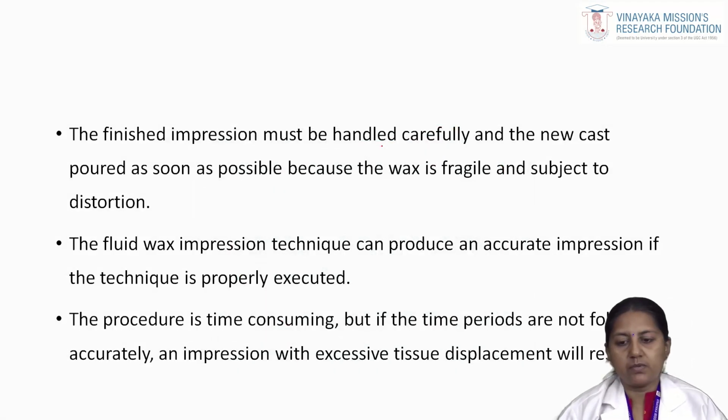The finished impression must be handled carefully and the new cast must be poured as soon as possible because the wax is fragile and subject to distortion. The fluid wax impression technique can produce an accurate impression if the technique is properly executed. The procedure is time consuming, but if time periods are not followed, you cannot get an accurate impression.